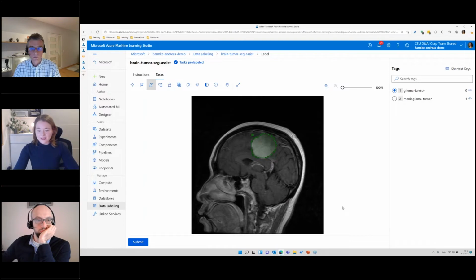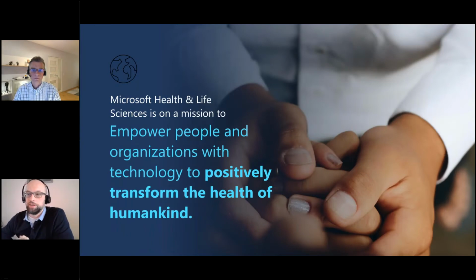And now with that, I would like to hand over to my colleague Ivan to share a bit on the more advanced labeling scenarios. Hello, everybody, and thank you, Harmke, for the introduction. Thanks, Andreas. Happy to be presenting here.